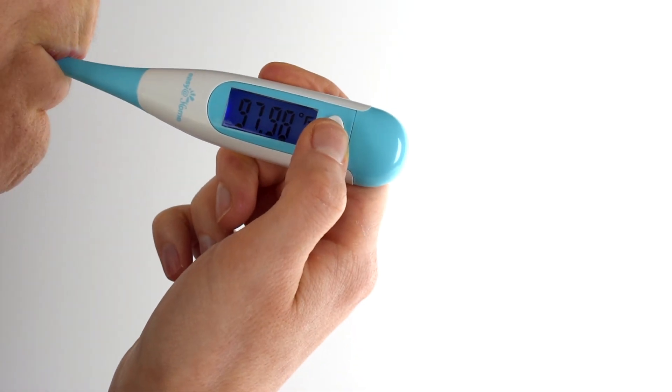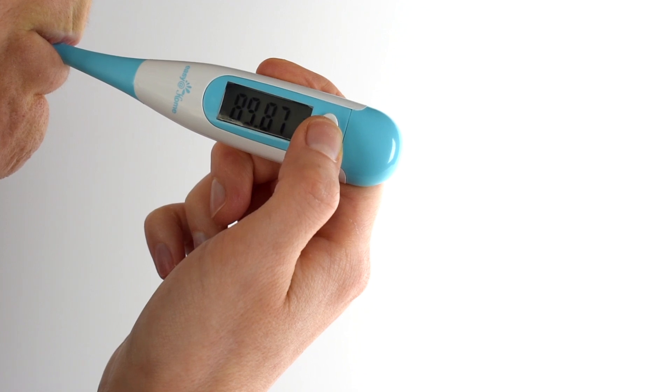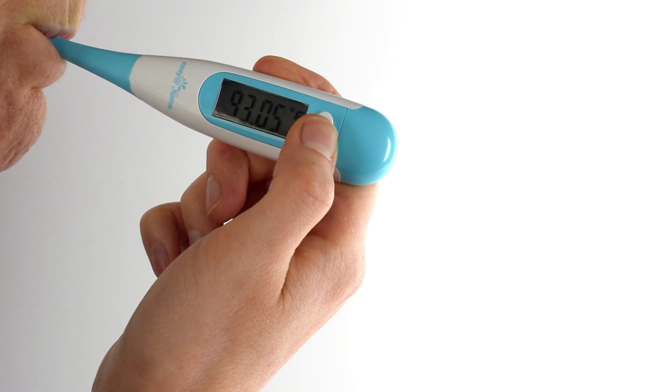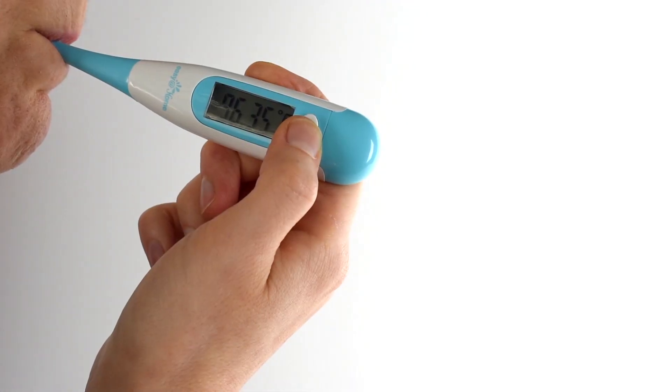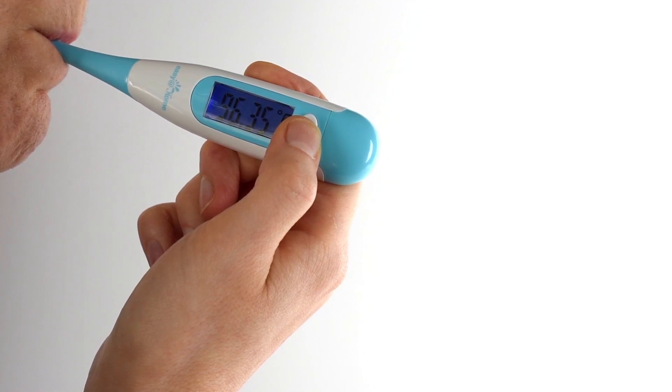Position the basal thermometer under your tongue and close your mouth. Various temperature readings will flash throughout the process for about 70 to 90 seconds. The thermometer should remain in constant contact with the tissue under your tongue. When you hear two consecutive beeps and the degree F or degree C symbol stops flashing, the measurement is complete. Then review your new temperature reading.